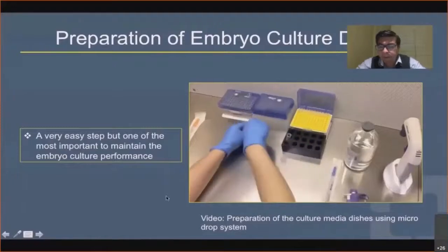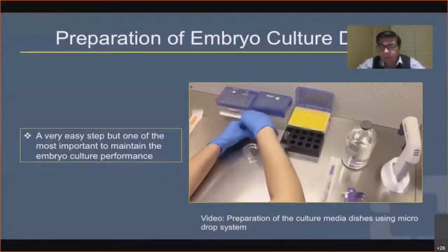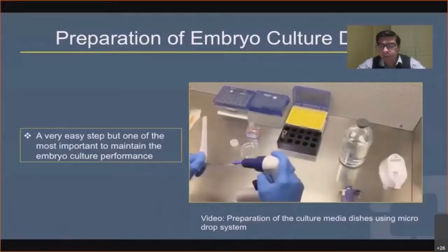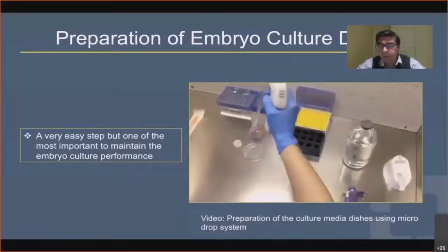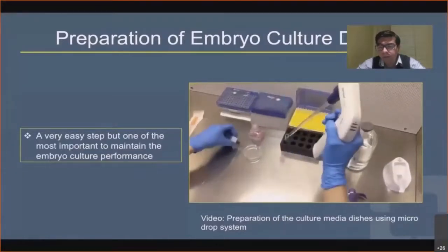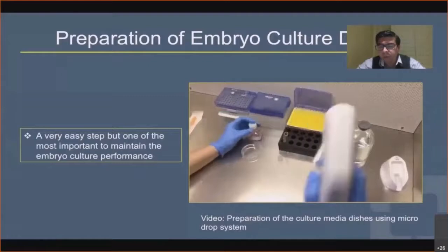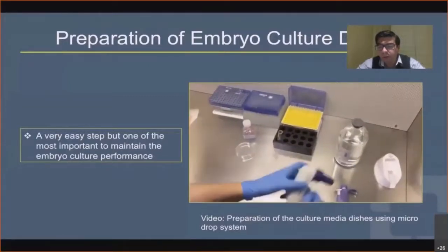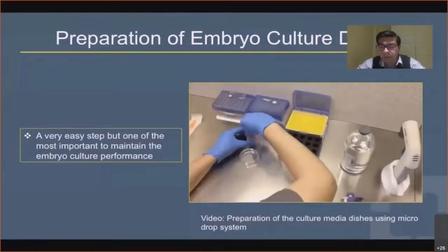In this video, you will observe our protocol to prepare the culture medium dishes using the microdrop system. You can also observe that the culture medium bottle was brought directly from the refrigerator when all supplies have been already set to prepare the culture medium dishes, in order to keep the culture medium bottle out of the refrigerator as little time as possible.